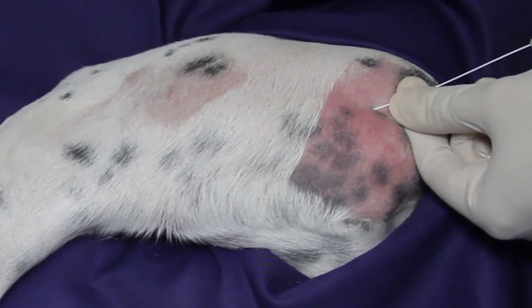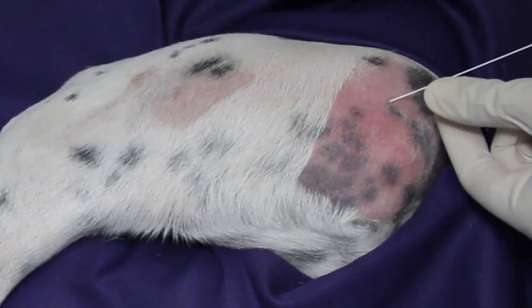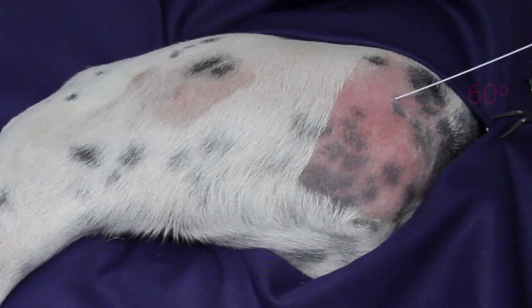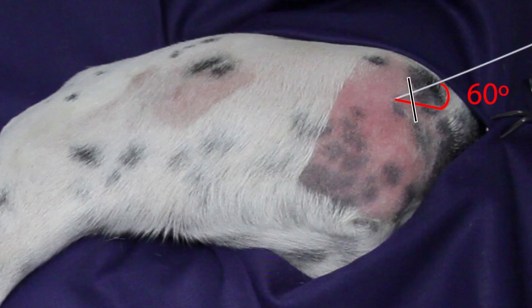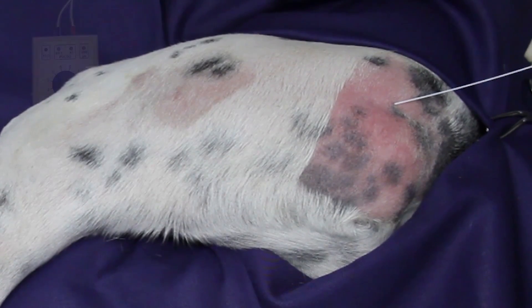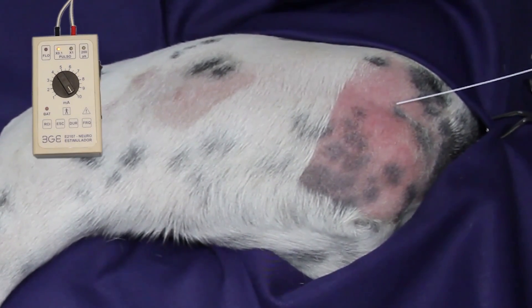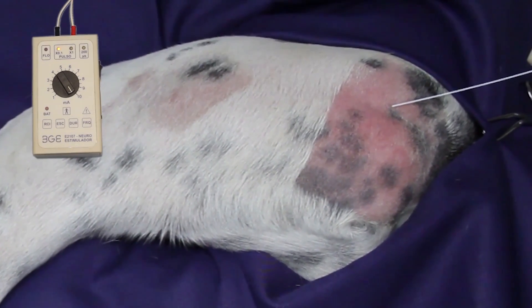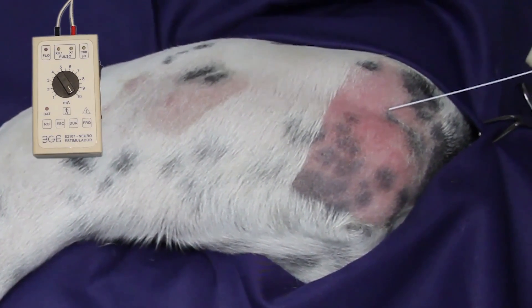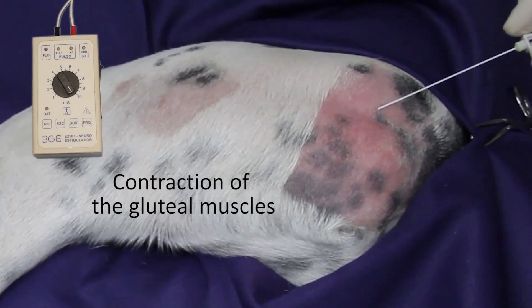The needle is inserted at 60 degrees with respect to the surface of the skin. The nerve stimulator is set to deliver an electric current of 1 mA at a frequency of 2 Hz.